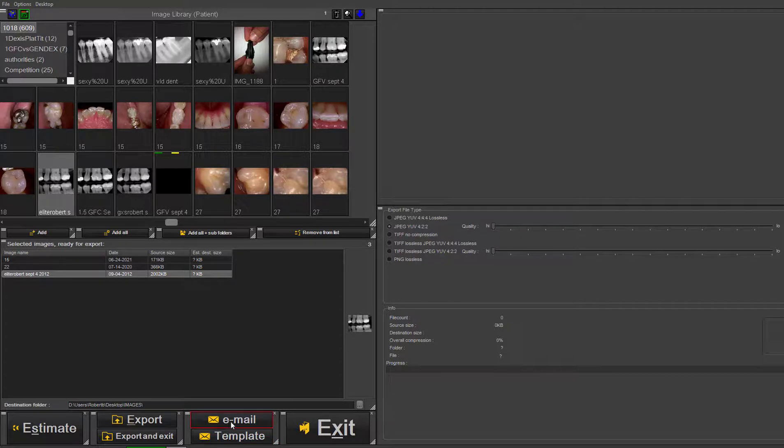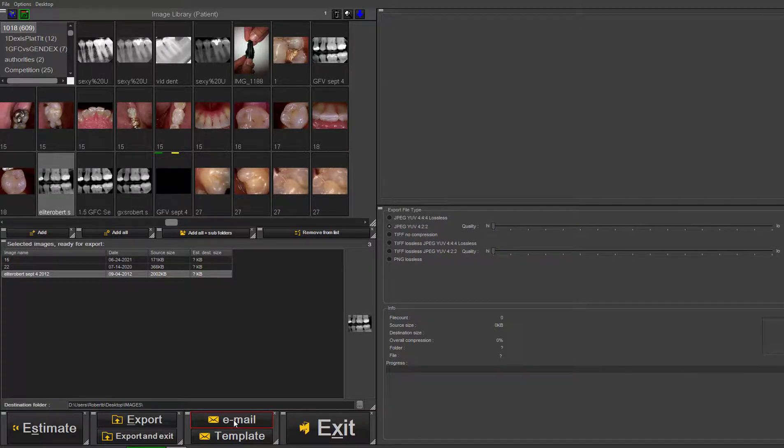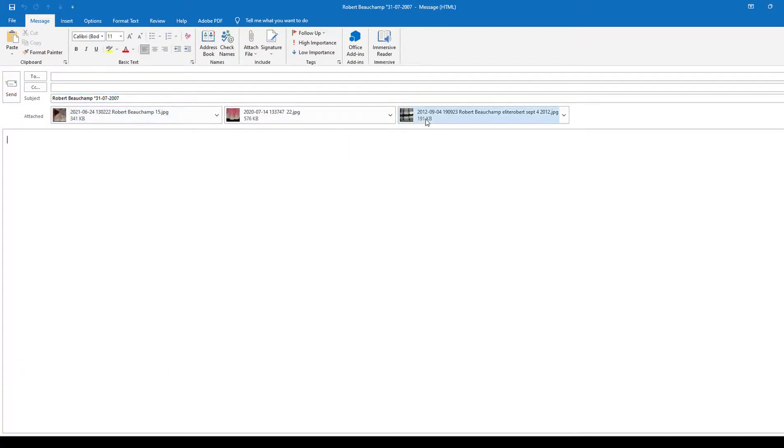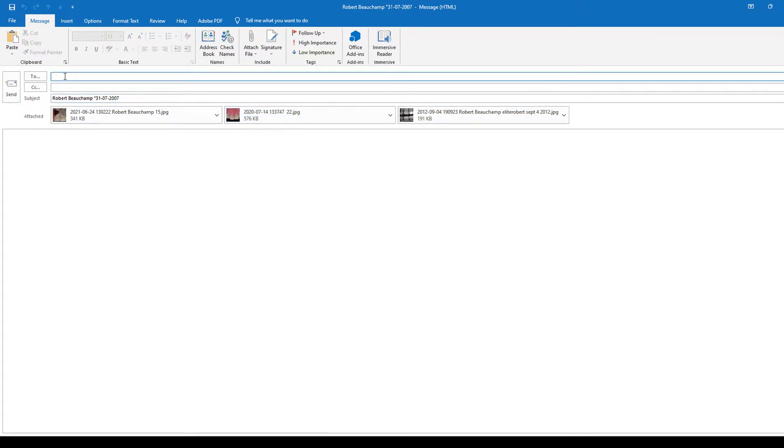I'll show the email feature in this video. If you have an email service on your computer, you just click on 'Email'. It will automatically open up an email with the images attached, and you can address it to whomever you'd like.